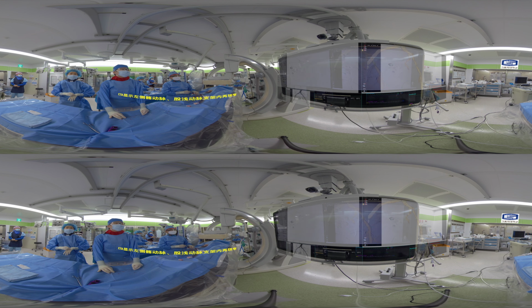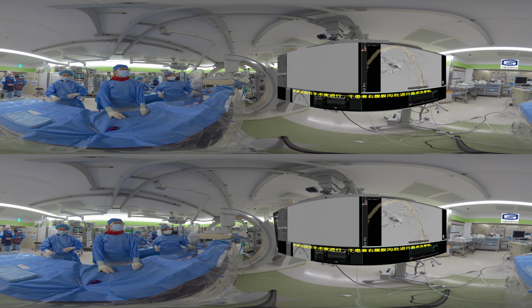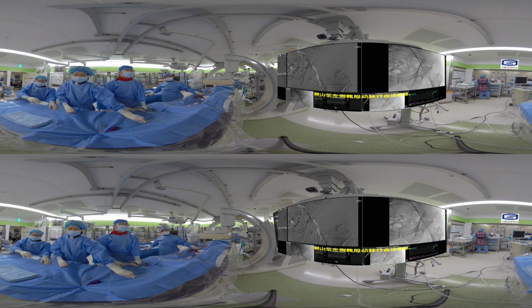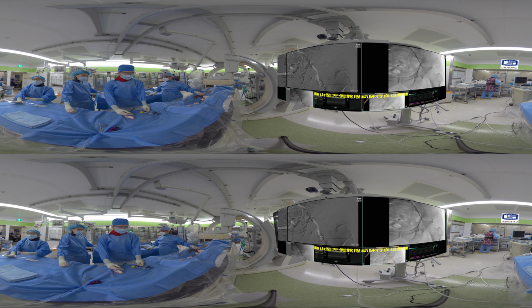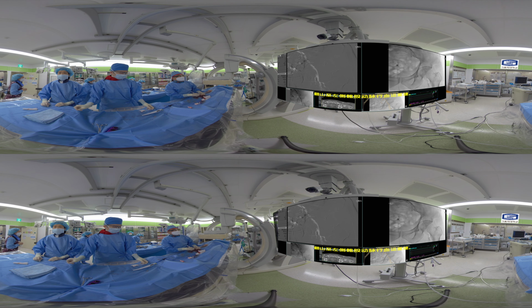Ankle brachial index was 0.5 in the right leg and 0.3 in the left leg. CT angiogram showed ISR lesions in the left iliac artery and left SFA. The patient was sent to the hybrid operation room and skin preparation was done in the right groin. A crossover retrograde approach from the right to the left iliofemoral artery was used for revascularization.